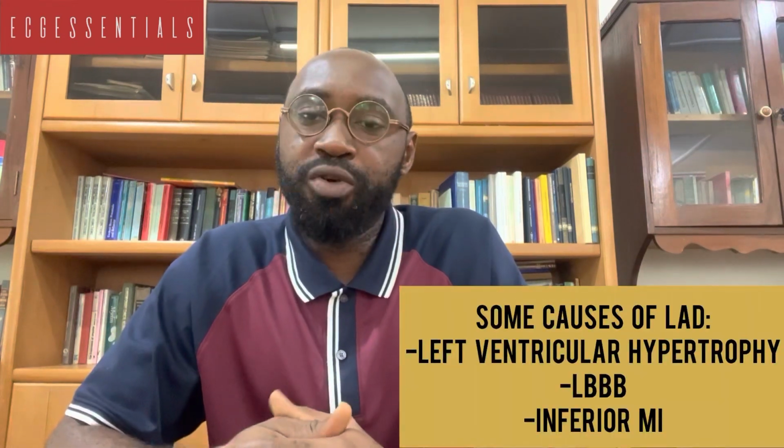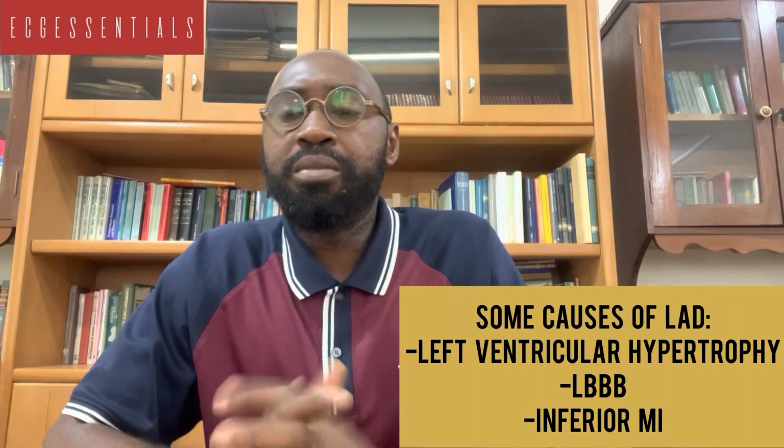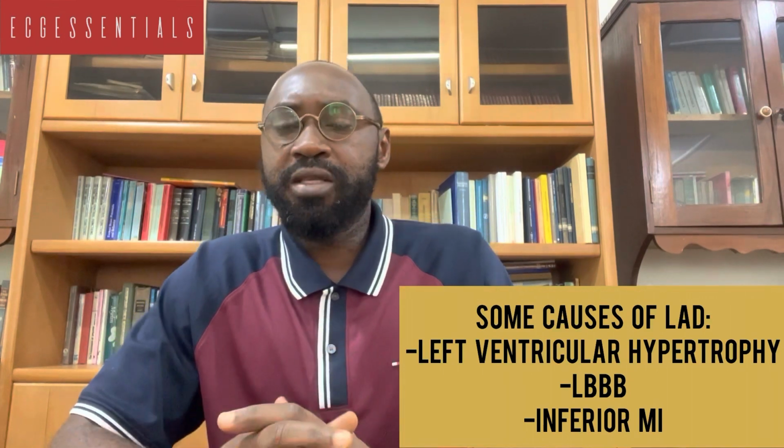For left axis deviation, again, left ventricular hypertrophy is a common cause, and then the other bundle branch blocks, particularly left bundle branch block. In inferior MIs as well, we can have left axis deviation. Okay, so as we said, we will be dealing with axis in detail. So this is just to scratch the surface.